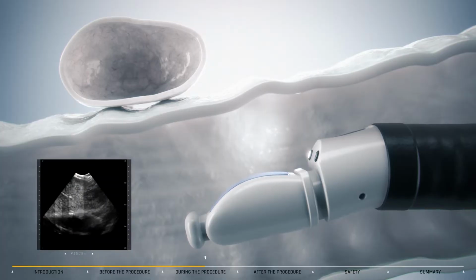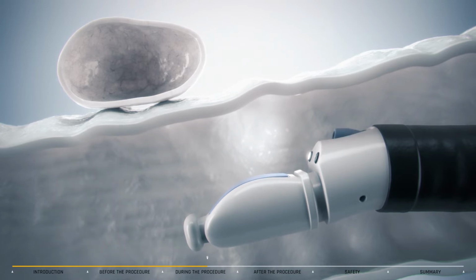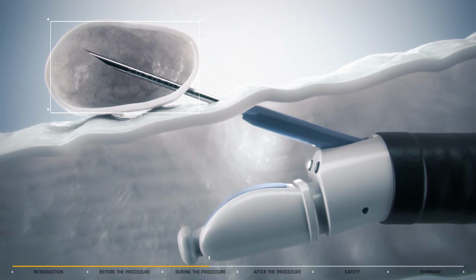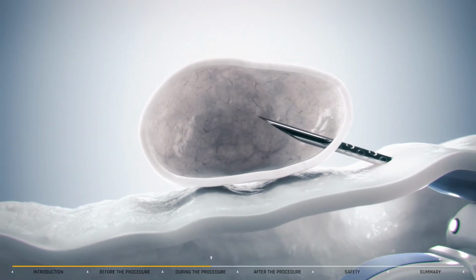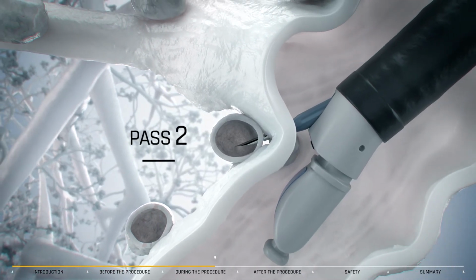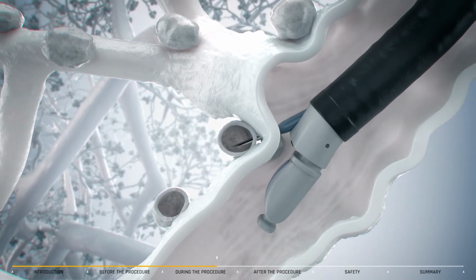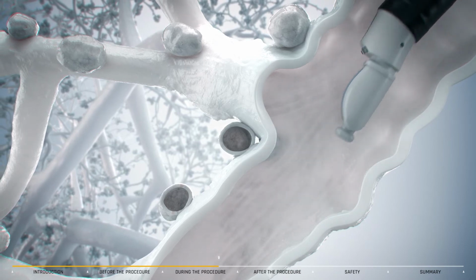Once the ultrasound imaging confirms the scope is in the correct location, if samples are to be taken, the needle will be passed down the tube and inserted into the target area. The needle may be moved back and forth for 10 to 15 seconds to ensure enough material is obtained. The operator will usually carry out at least 4 separate passes into the target lymph node to ensure sufficient material is acquired. To conclude the procedure, which usually lasts 30 to 40 minutes, the needle and then the EBUS scope are withdrawn.